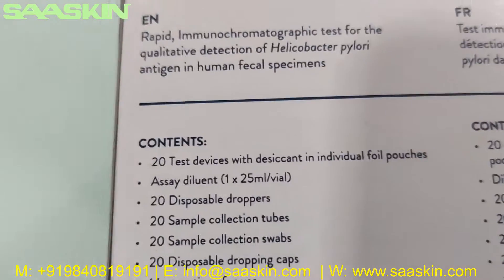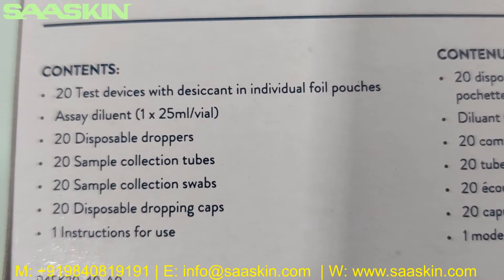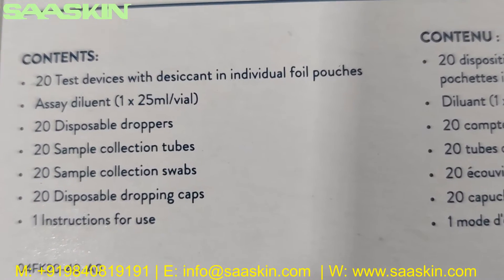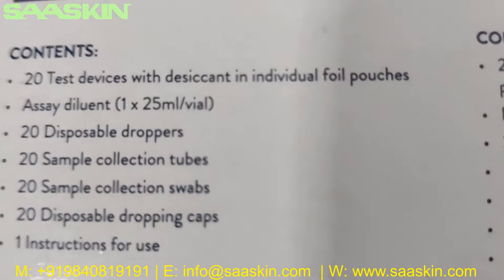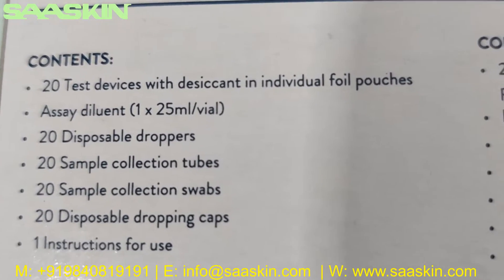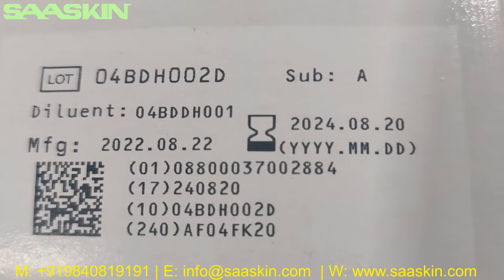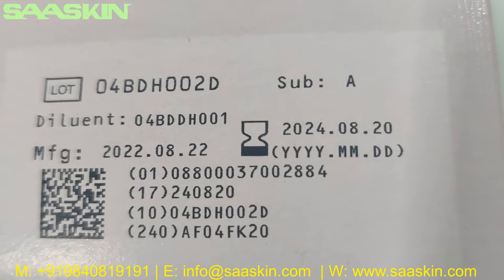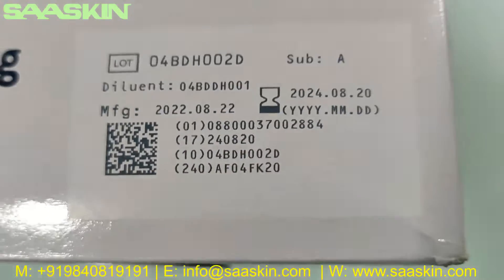We have that in all languages also. In the standard box you have the following contents: 20 test devices, 20 disposable droppers, 20 sample collection tubes, 20 sample collection swabs, 20 disposable dropping caps, and one instruction for use. On the other side you can see the reference part number, manufacturing date, and also the expiry date. On standard you have a 2-year expiry period for this product. You also have the diluent details.